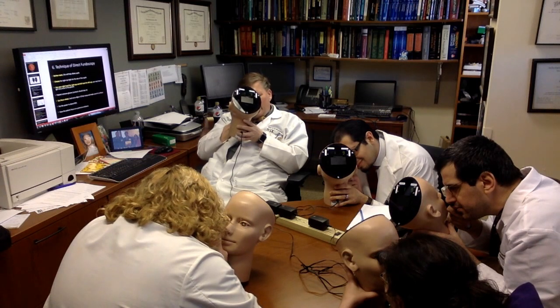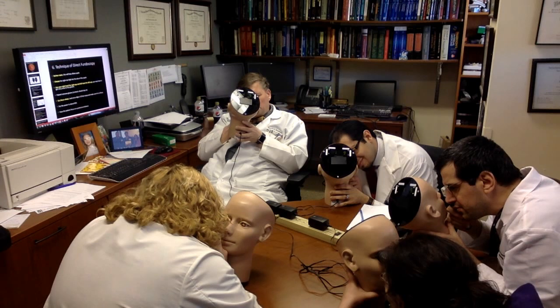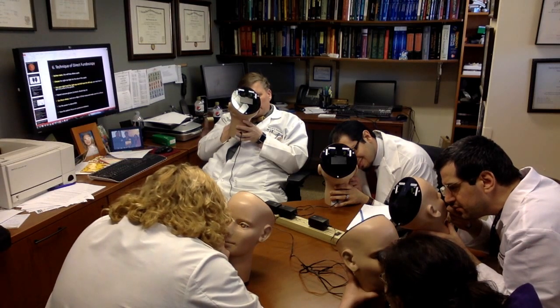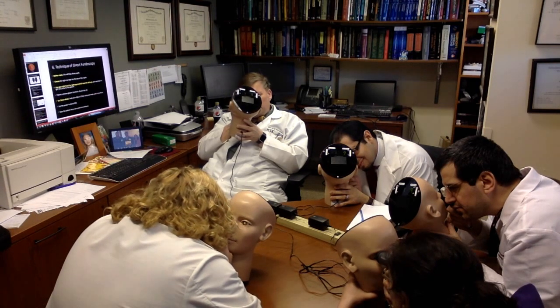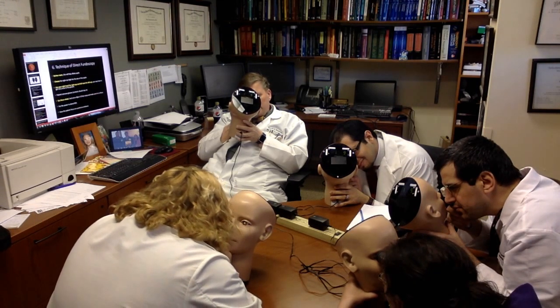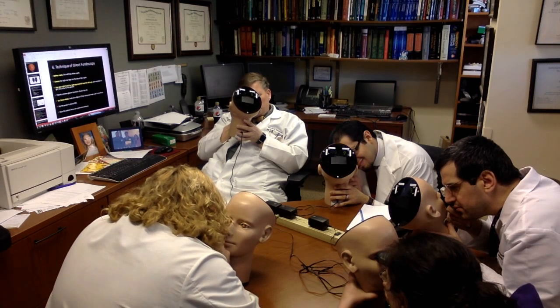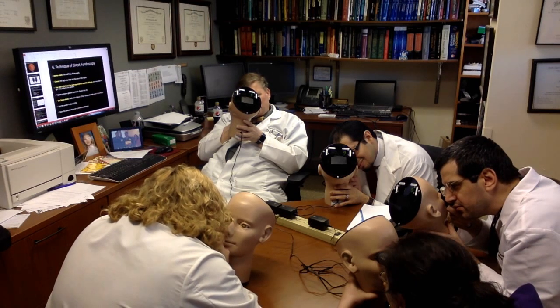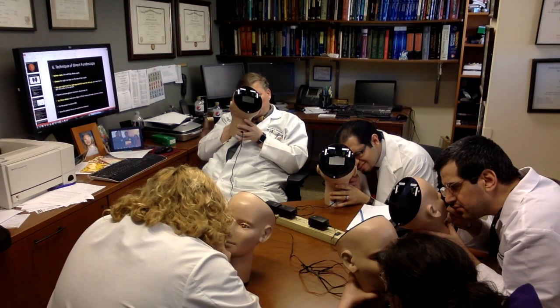Good. Now, how do you tell the difference between an artery and a vein? Because they tend to run very close to each other. In general, the veins are bigger. Most veins in the body are bigger than the arteries. Plus, the veins are darker and redder because they carry venous blood, or deoxygenated hemoglobin. For instance, if you look at 6 o'clock, 7 o'clock, you'll see 2 vessels going down, a thicker one on top and a thinner one on the bottom. The thicker one, which is redder, is the vein. The thinner one is the artery. Does everyone appreciate that? Yes.